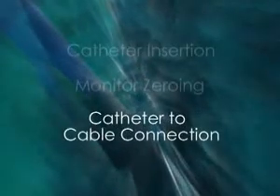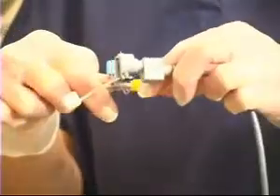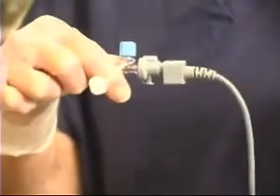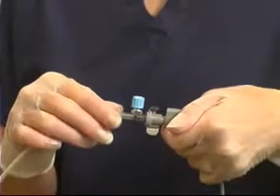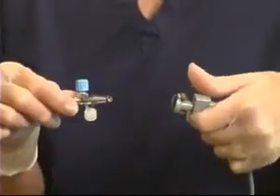The third and final step is the catheter to cable connection. Insert the catheter connector into the reusable cable. A distinct click will be heard and felt. The catheter is then locked into place. To remove the catheter, simply press the connector clip and separate the catheter and cable.